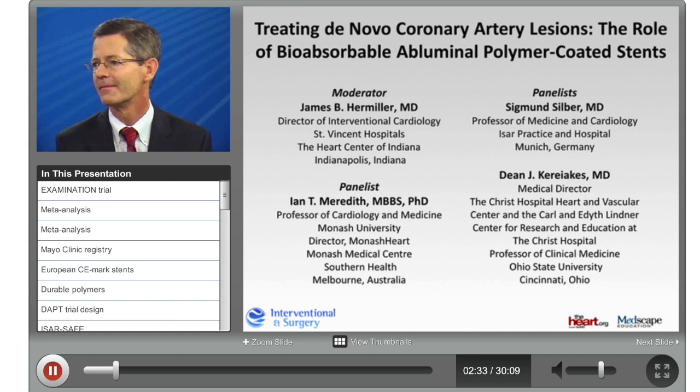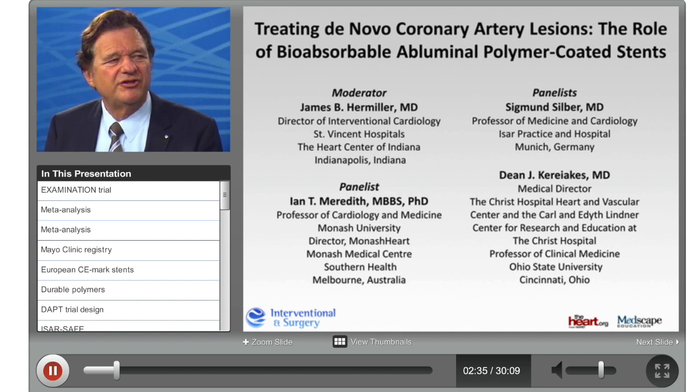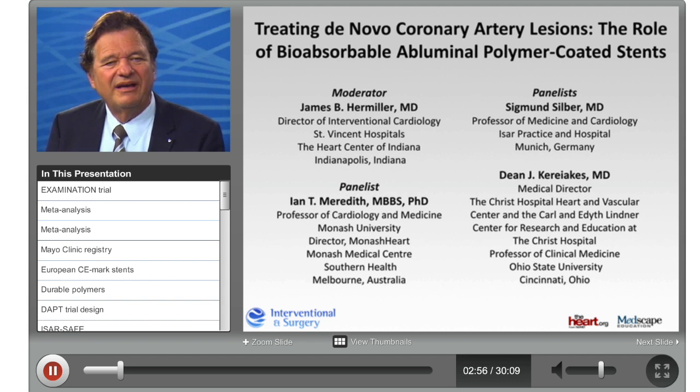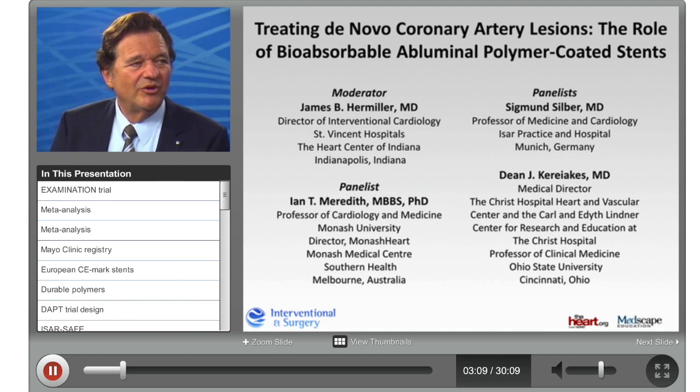Yeah. Well, I agree with that. But we have to differentiate in the durable polymers, maybe the first generation and the newer generation durable. So there was considerable progress, even with durable stents, with better long-term results than the first durable drug-eluting stents. But still, there's always something in your mind that durable means forever. And I think we as physicians, if we implant something for the patient for the rest of his life, we would rather have something which disappears slowly just to make sure it won't stay forever. However, we need more data on that, of course.